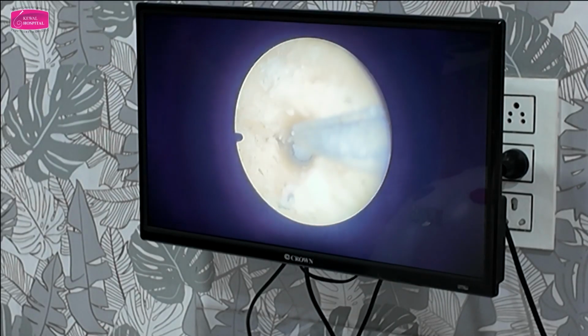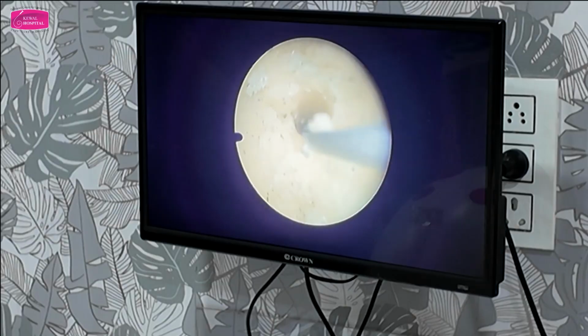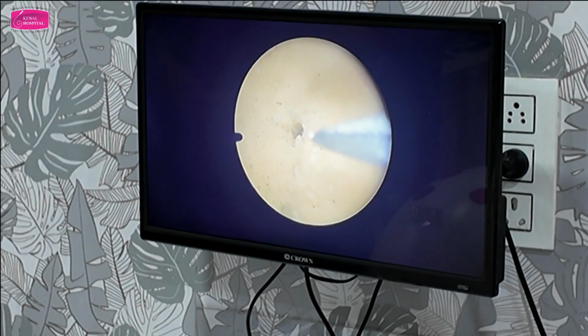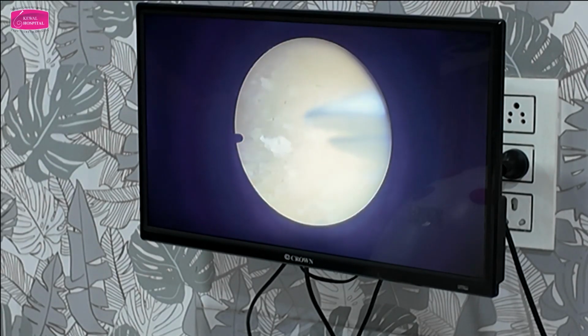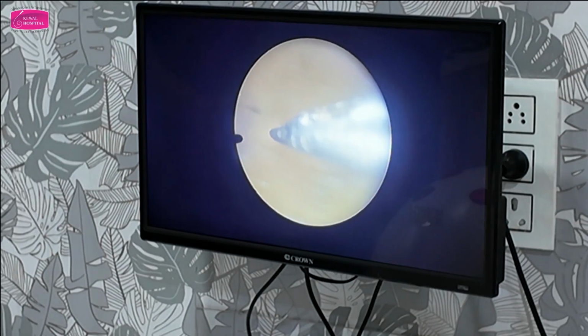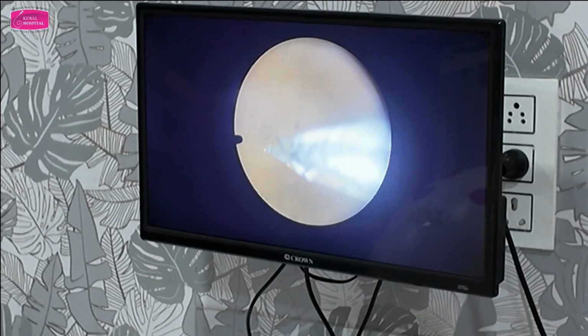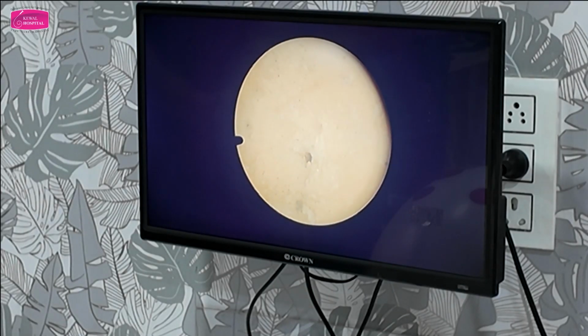Yes. Sometimes there are flimsy adhesions on the ostia, so you can introduce the scissors and just cut the flimsy adhesions. Whatever things you want to do, you can do with the scissors. You want to do the metroplasty, you can do the metroplasty also. On this side also. Metroplasty, whatever pathologies you want to do, you can do. I think it is clear. Is it clear now? Yes.